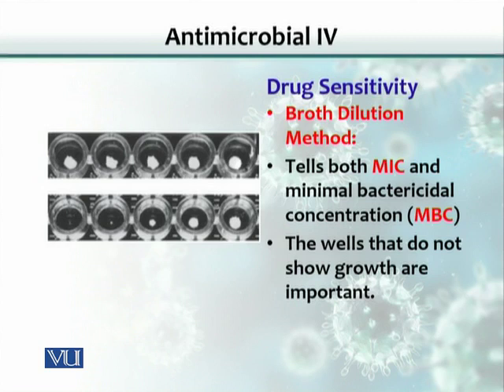The beauty of this broth dilution test is that you can test whether the antibiotic is bactericidal or bacteriostatic. If you take one higher concentration than the minimum inhibitory concentration, like in this case well number 1, take the bacterial cells that are there, inoculate them on a fresh agar plate, and incubate it overnight, there could be 2 scenarios: there is growth or there is no growth. If the plate shows growth, it tells you that the microbes were lying there intact but were not replicating. So that means the drug had a bacteriostatic effect.